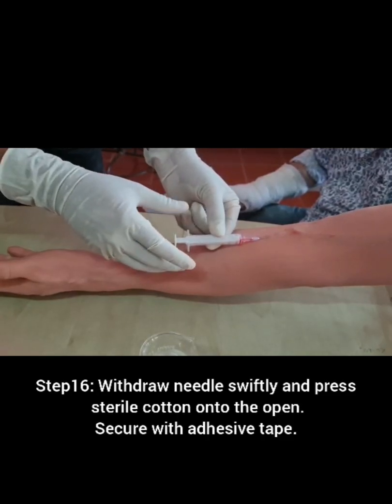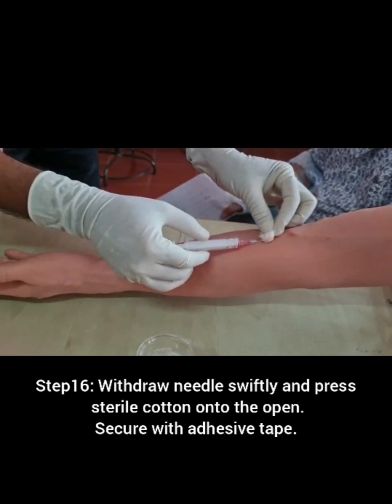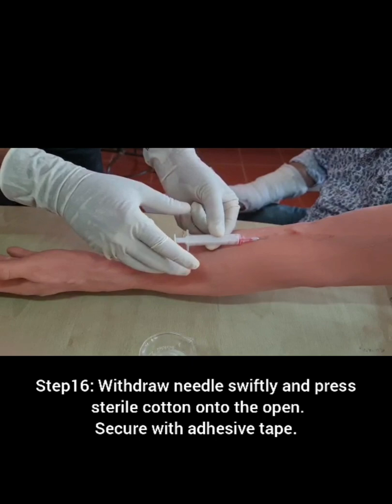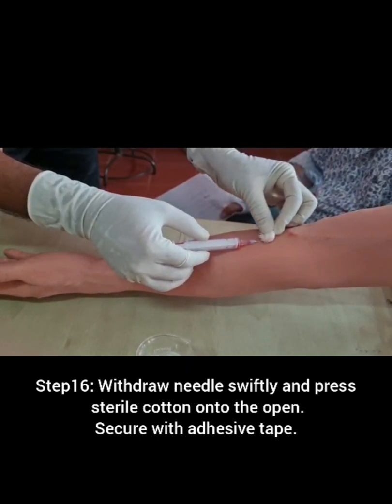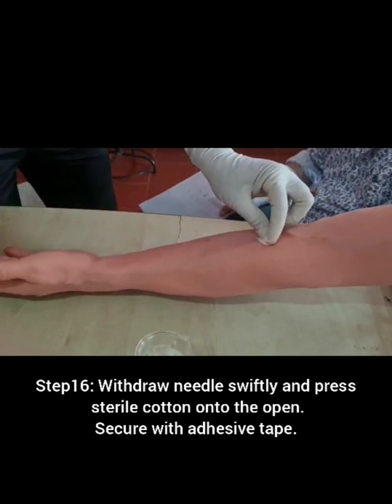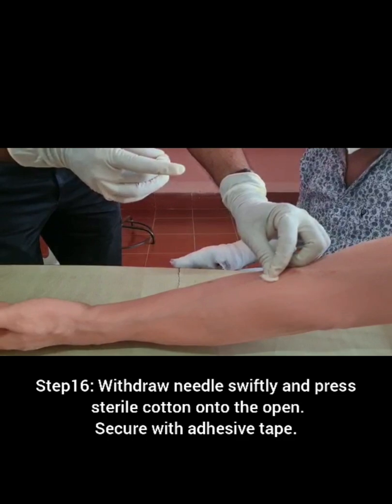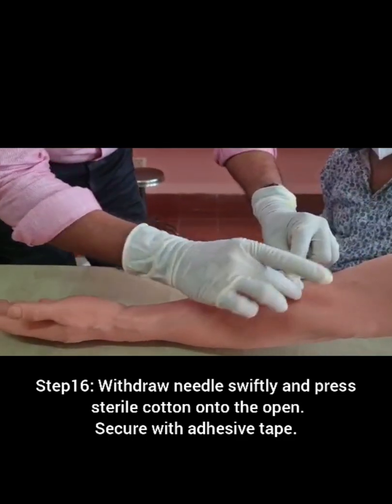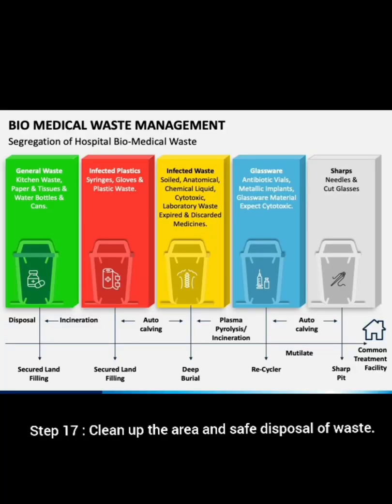Withdraw the needle swiftly, press sterile cotton onto the opening, and secure with adhesive tape. Clean up the area and ensure safe disposal of waste.